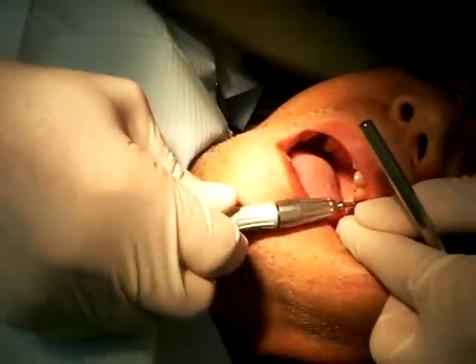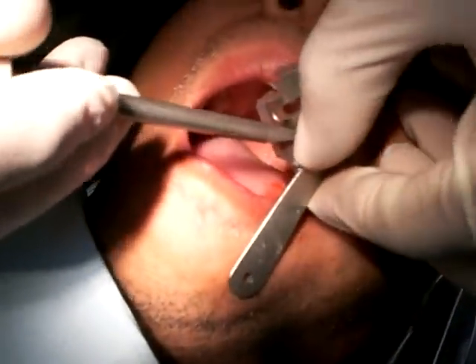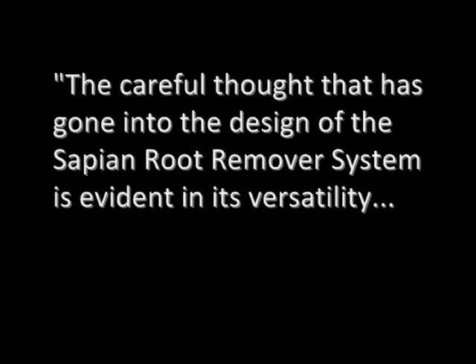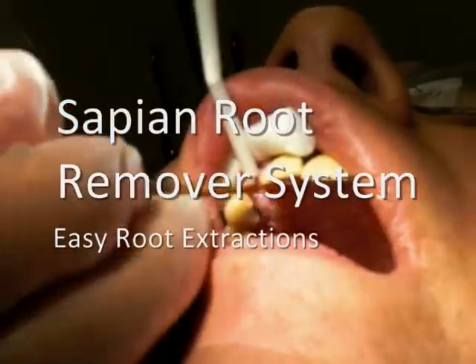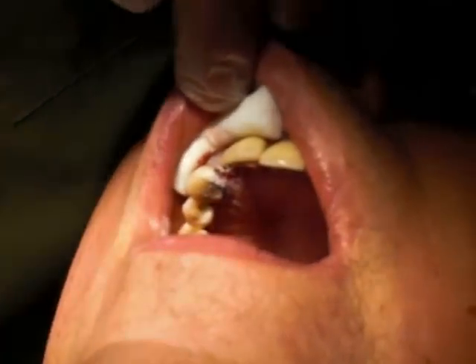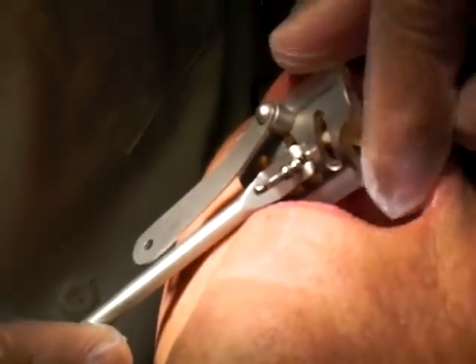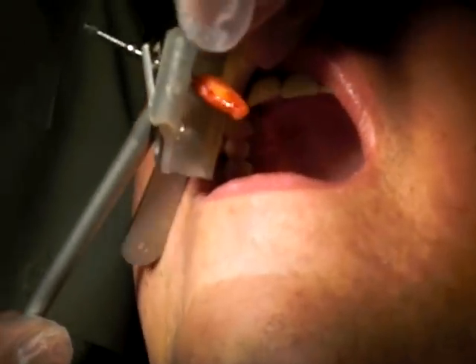No pressure. I feel a little pressure. There it is, right there. Between the root of the tooth and the bone we'll loosen up. You're in the anterior drive. Got a little pressure. There it is — there's the root.